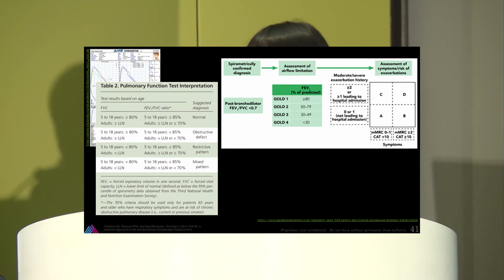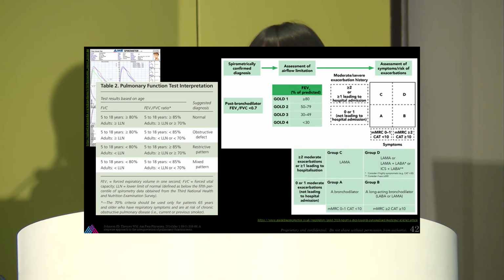So if you're able to diagnose somebody's COPD and give them an FEV1 value, perhaps not even in an outpatient setting, but even in the ED setting when people have said obviously don't do it, the spirometry value is not as good in the acute setting, maybe it's time to revisit that because there's opportunity here to look at the radiograph and the PFT values.